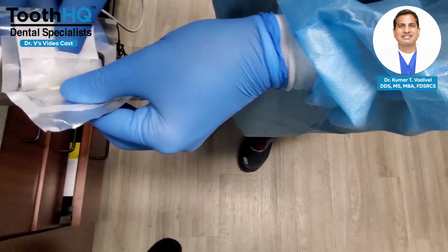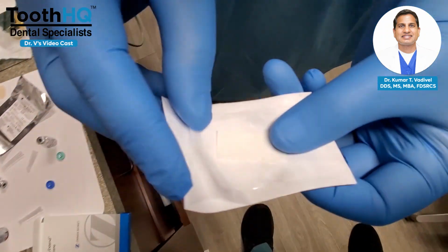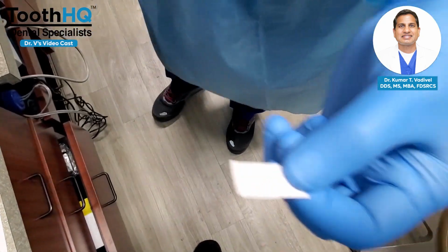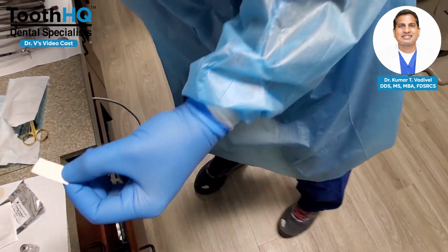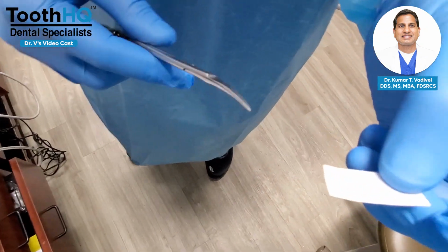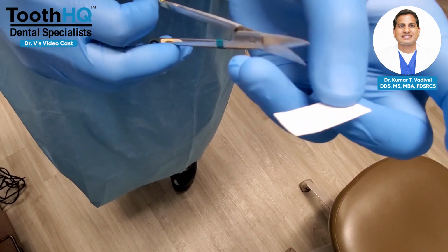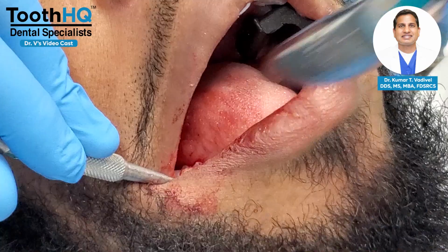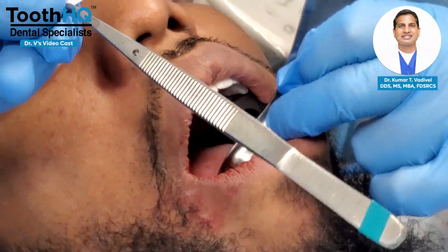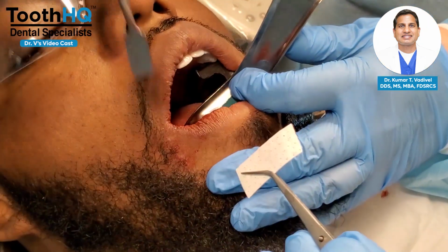So now I'm going to open the membrane. So the membrane is going to look like this. And if necessary, you can cut and trim. I took it out, and this is the membrane here. If your socket is smaller, you can always cut and trim to the size that you want. Okay. I have the membrane in my hand here, and I'm going to keep my scissors handy just here, just in case I have to trim the membrane.